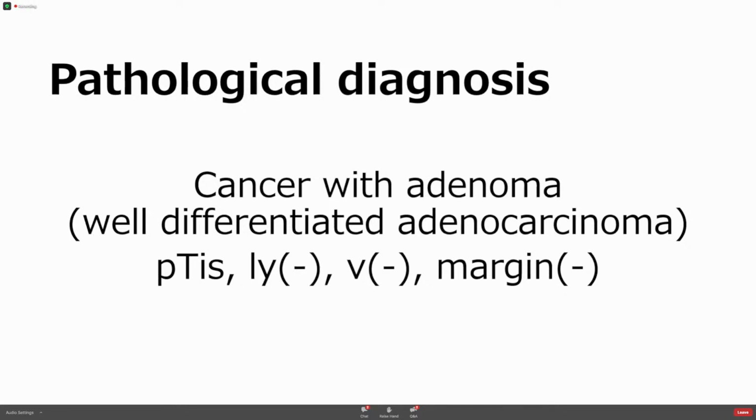Yeah. If the margin was negative, we usually perform follow up 1 year later. If this is not cancer but adenoma, we usually perform the EMR surveillance at 3 years. However, for a region like this, mucosal cancer, we perform it 1 year later. 1 year. Okay.